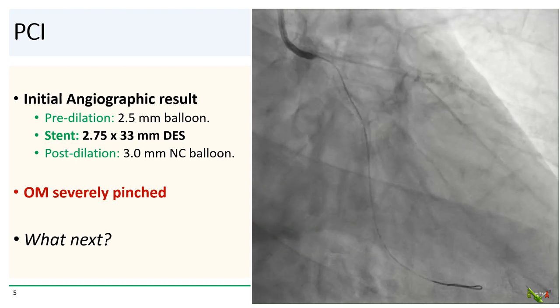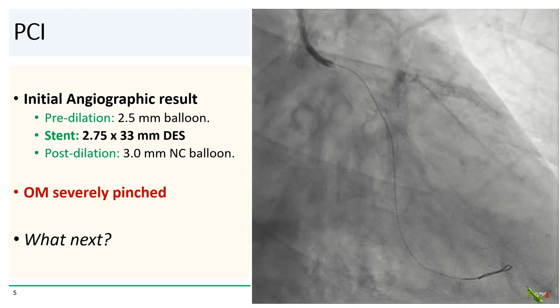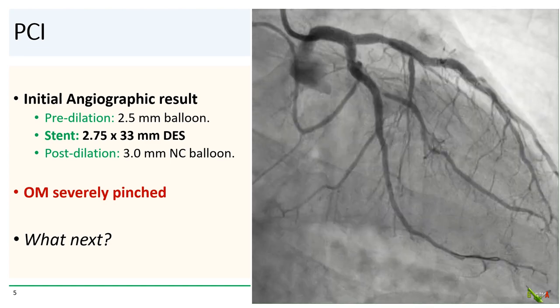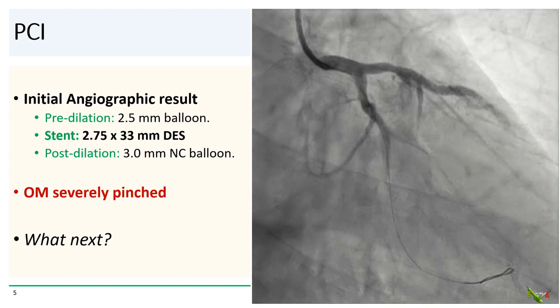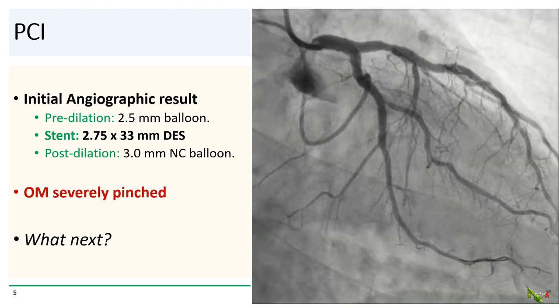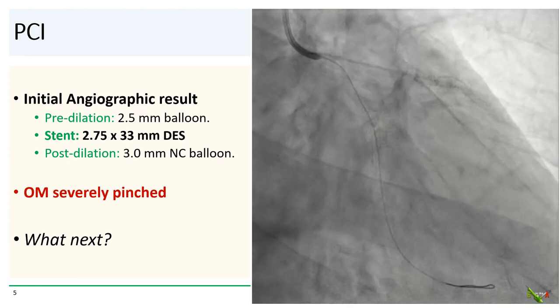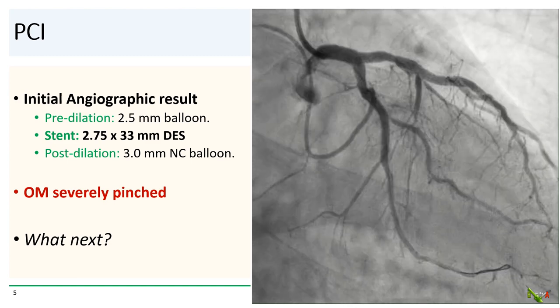Here is the angiographic result after pre-dilating the circ with a 2.5 balloon, stenting with a 2.75 by 33 millimeter DES, and post-dilating with a 3.0 NC. While the circ looked pretty good, the ostium of the jailed OM is severely pinched. So what do we do next?